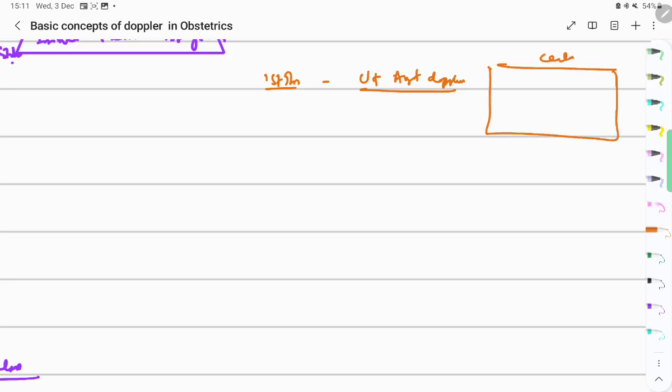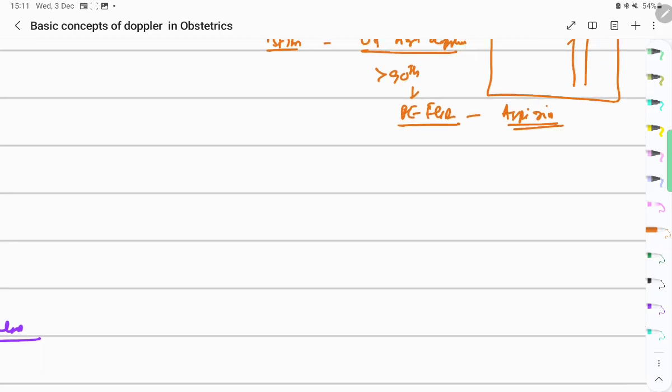In the centile chart, if it is more than the 90th centile, then there is high risk of preeclampsia and FGR, and I will counsel her and start low dose aspirin 150 mg once daily till 36 weeks.